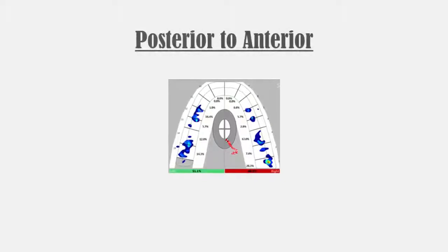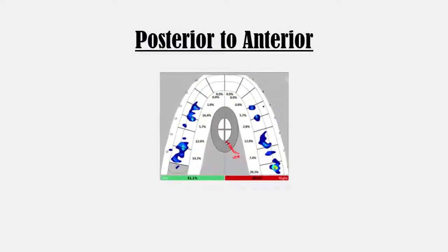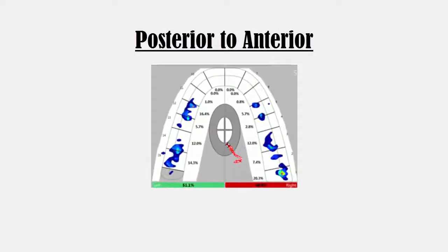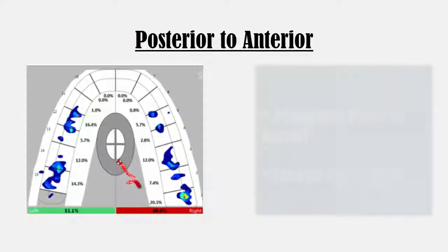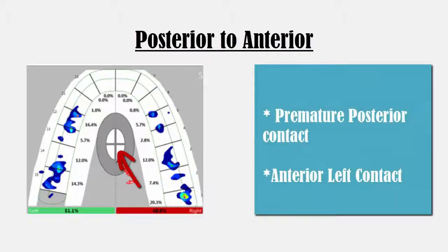The third example shows the center of force starting from the right posterior and moving anteriorly towards the middle of the arch. This center of force pattern demonstrates a premature posterior right side contact followed by an anterior left contact, which causes the trajectory path to move diagonally from the right posterior to the left anterior teeth.